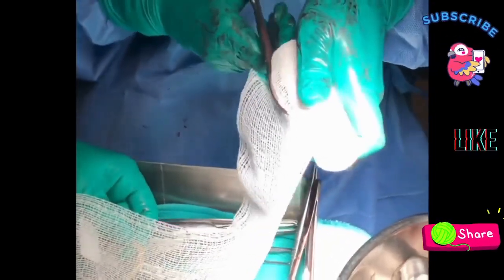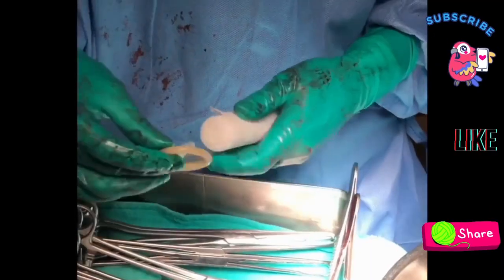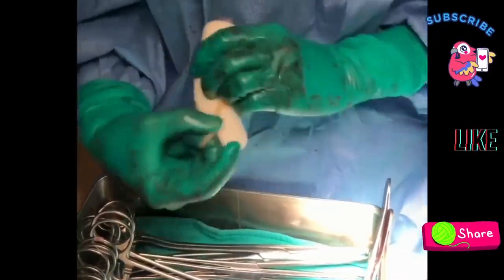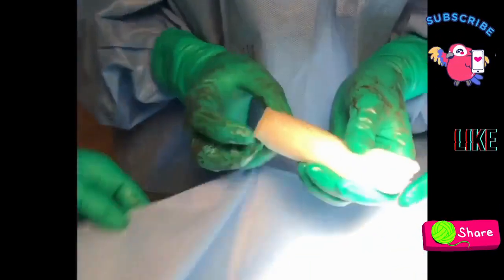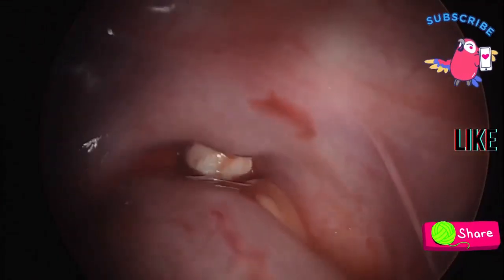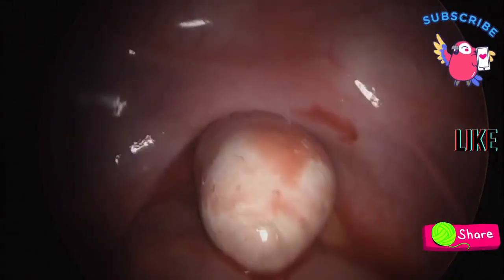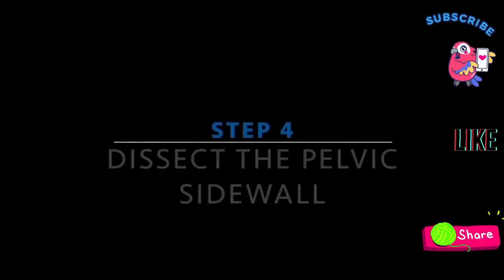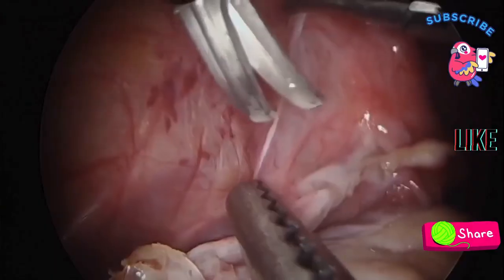In the absence of commercially available vaginal stents, a vaginal stent 2 finger breadths wide is created using sterile gauze covered by 2 latex-free condoms. It should measure around 10 centimeters in length and 3 centimeters in width. The vaginal stent is then inserted into the neovaginal space.